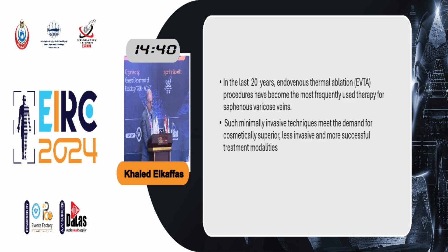In the last 20 years, endovenous thermal ablation procedures have become the most frequently used therapy for saphenous varicose veins. These minimally invasive techniques meet the demands for cosmetically superior, less invasive, and more successful treatment options.